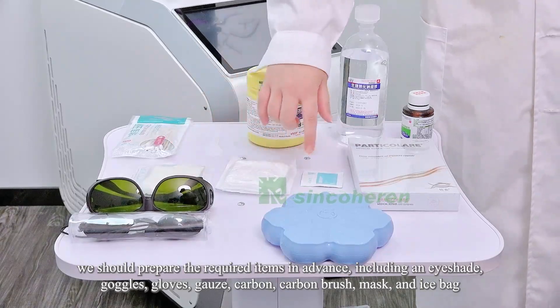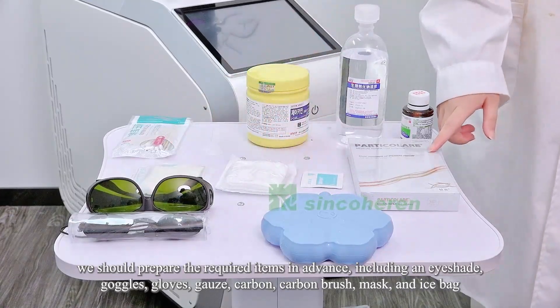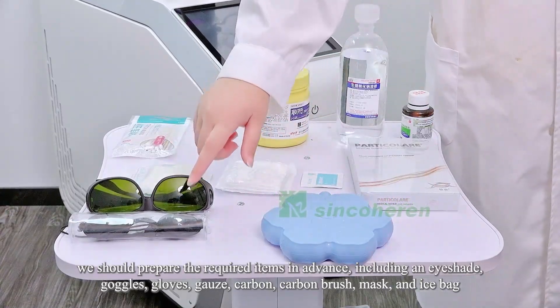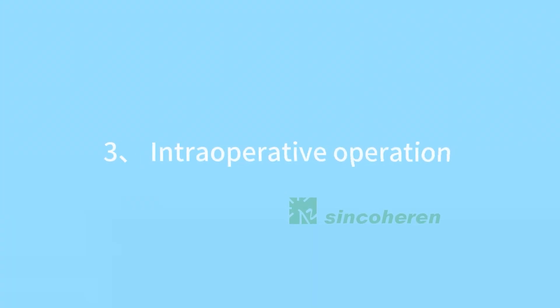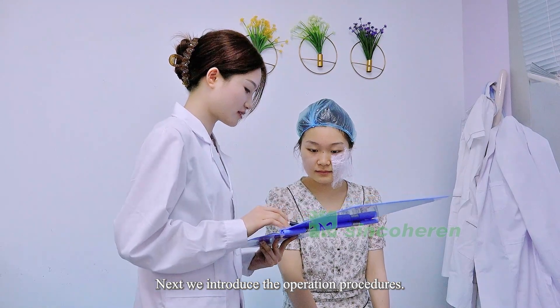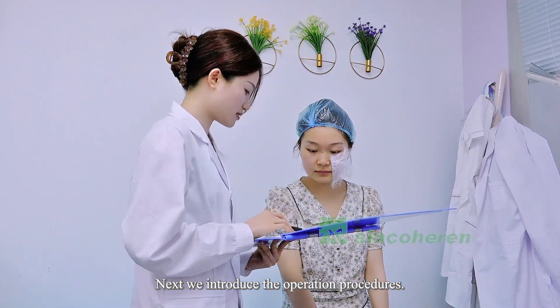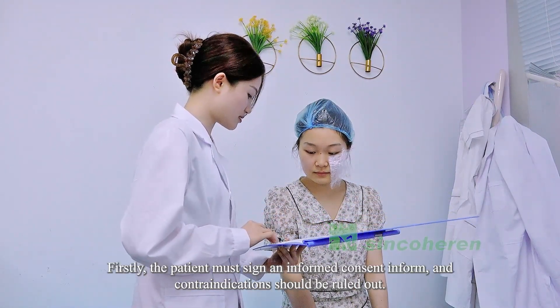Before the treatment, we should prepare the required items in advance, including an eye shade, goggles, gloves, gauze, carbon, a carbon brush, a mask, and an ice bag.